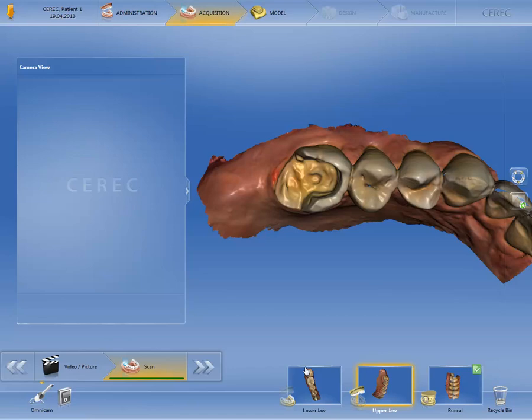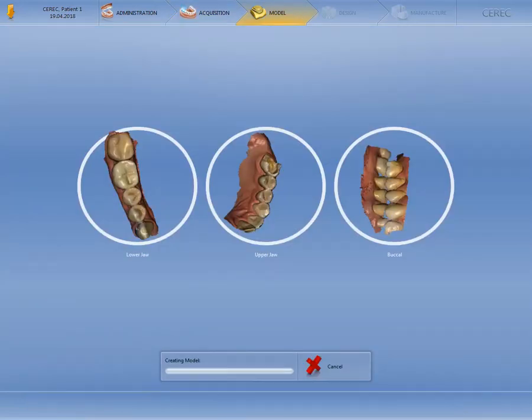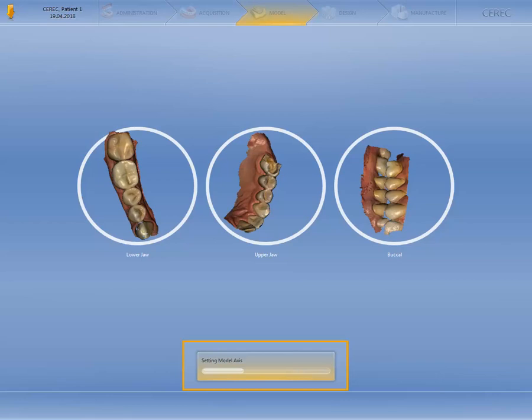As our restoration is placed at the end of the jawline, we have scanned more teeth in the mesial direction. By clicking on the double arrow, we move to the next phase, the model phase. The CEREC software is now generating the 3D model. On the lower edge of the screen you can see which calculation is currently running. First, the software generates the models. Afterwards, it defines the model axis and then draws the preparation margin.